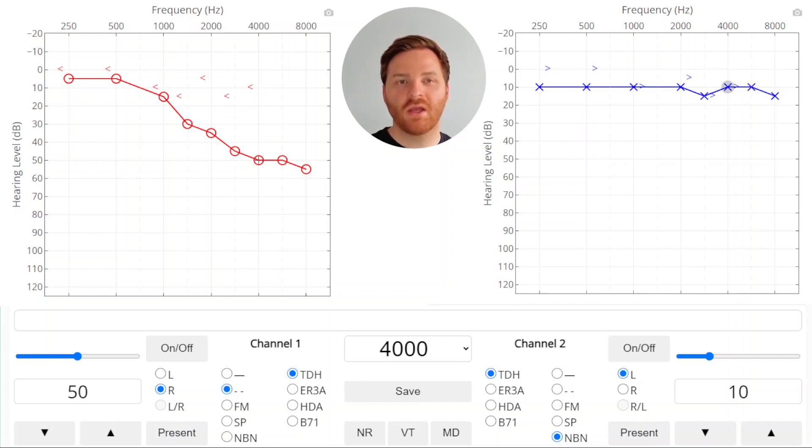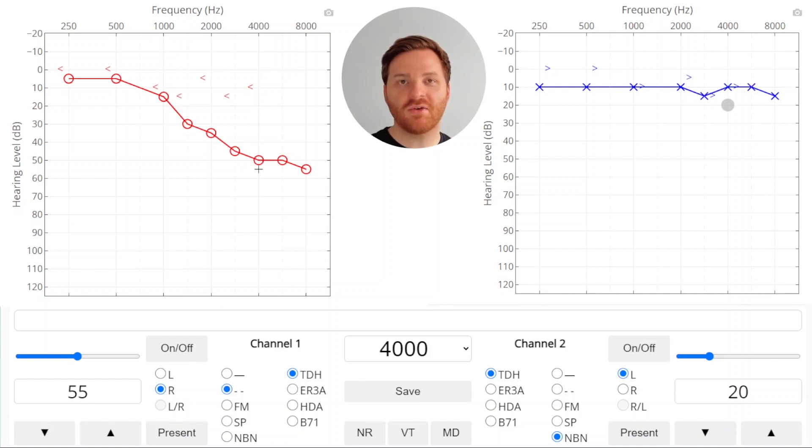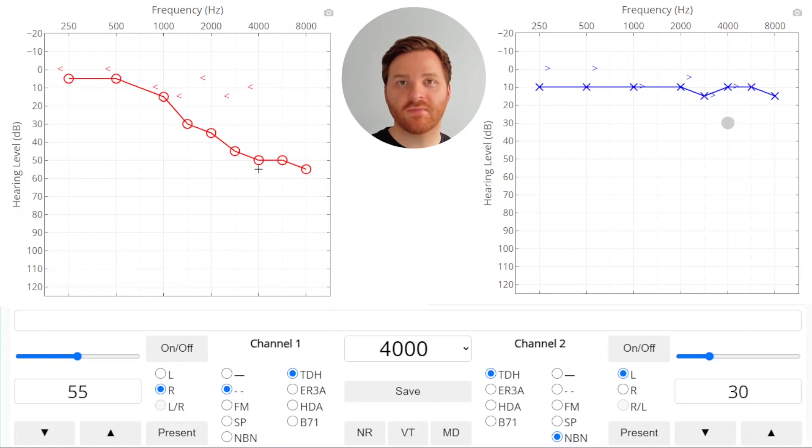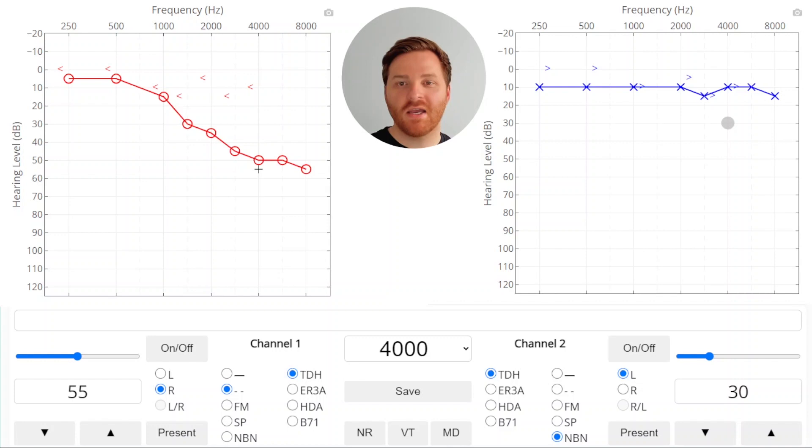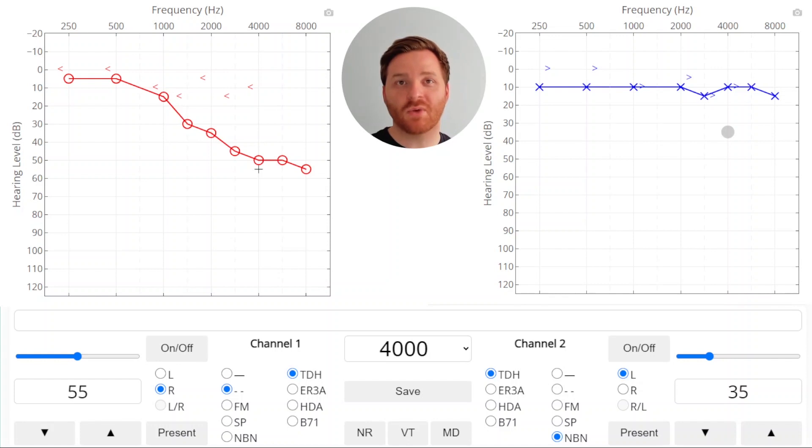We'll turn on our masker and remember that our starting masking level is the air conduction threshold of the non-test ear plus a 10 dB safety pad. We'll present our stimulus and we get no response. When you get no response you raise your stimulus by 5 dB until you get a response. Once you get a response you raise the masker and we got a second response. So we raise our masker. We now have a third response after raising the masker twice. You can continue to do this and continue raising the masker to ensure and help you feel confident that the non-test ear isn't responding. This helps me feel more confident that I'm at the masked threshold in the test ear. So I'll save this as a masked right threshold.